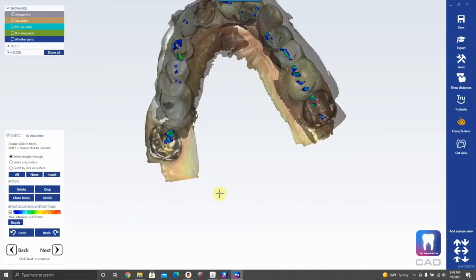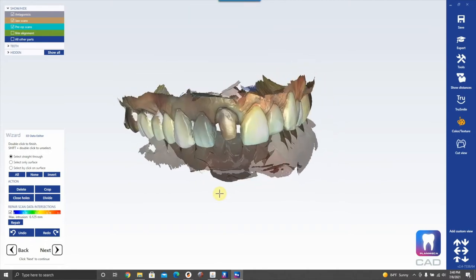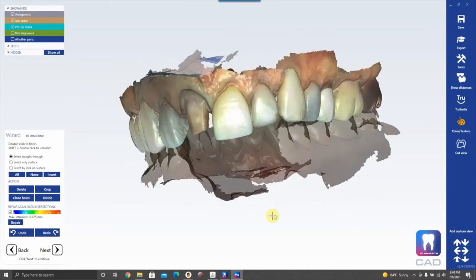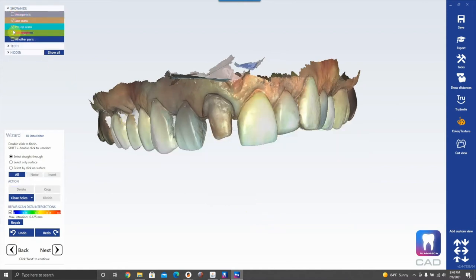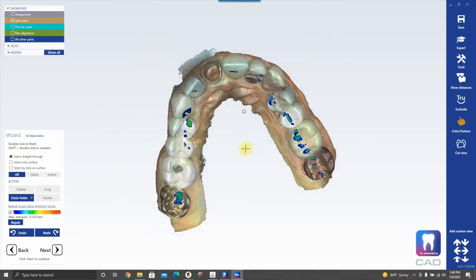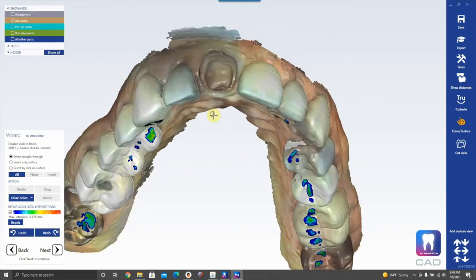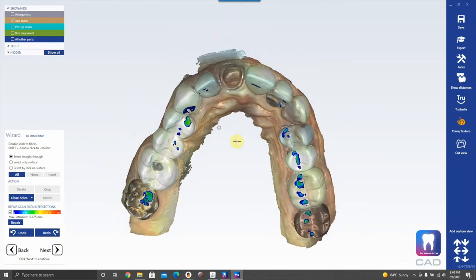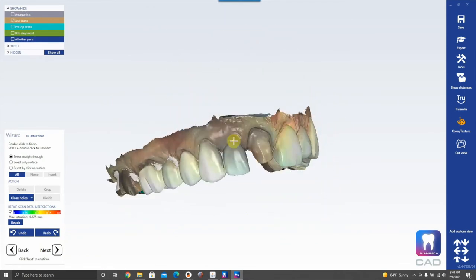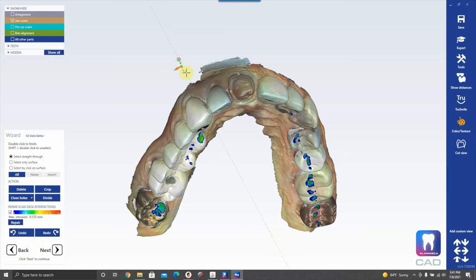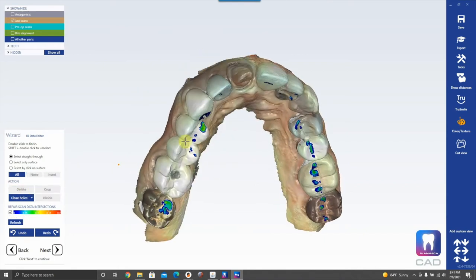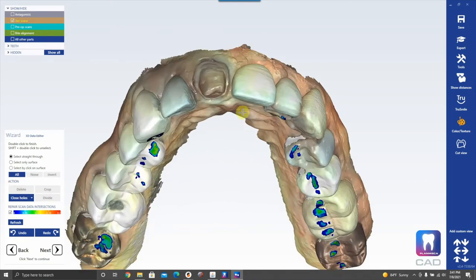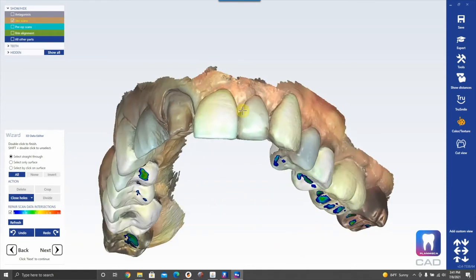The next step asks you to edit the scan data. Turn off the antagonist and pre-op so you're just looking at your prep scan. I don't really need to edit this because there isn't much flash, but if you want to remove something, use Click and Circle to select it, then hit Delete.